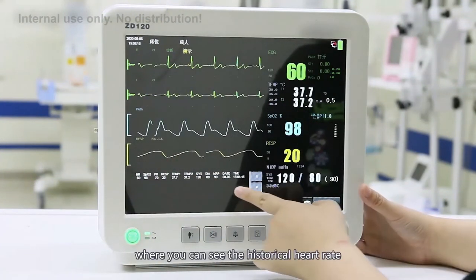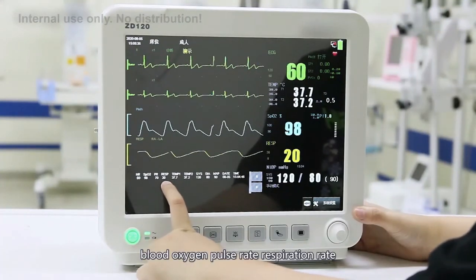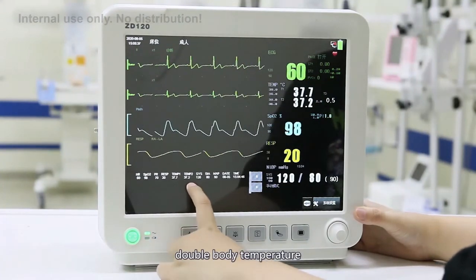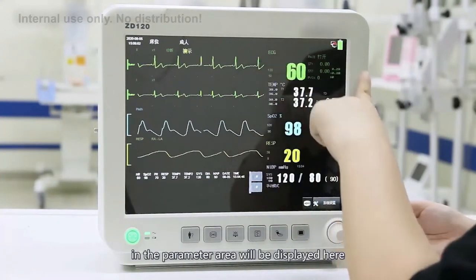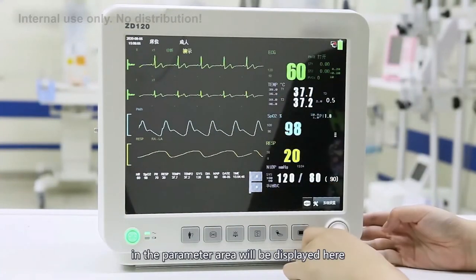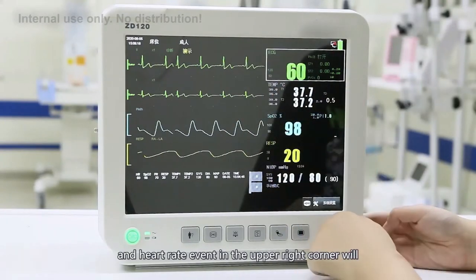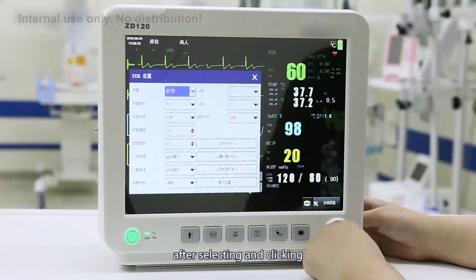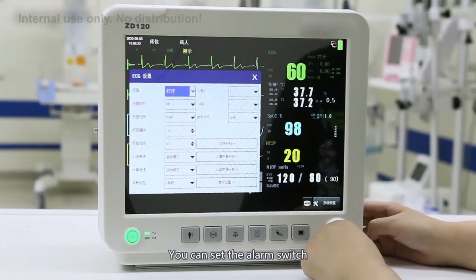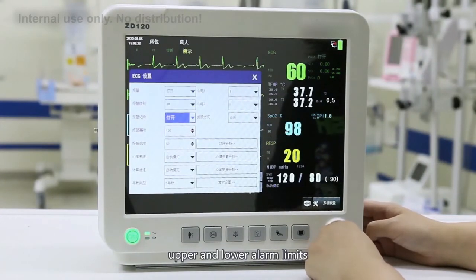Below the waveform area is the event list, where you can see historical heart rate, blood oxygen, pulse rate, respiration rate, dual body temperature, and blood pressure measurement values. The real-time measured data in the parameter area is displayed here. Selecting the heart rate value, ST segment value, or heart rate event in the upper right corner will open the ECG setting interface, where you can set the alarm switch, alarm level, alarm record, and upper and lower alarm limits.